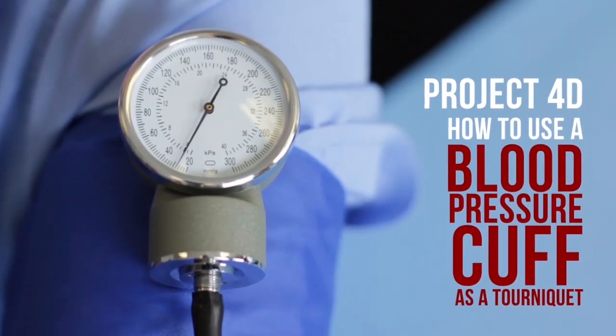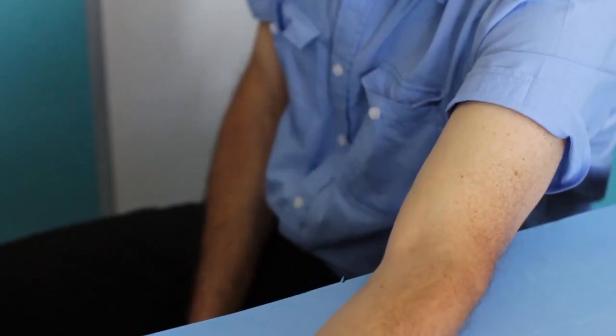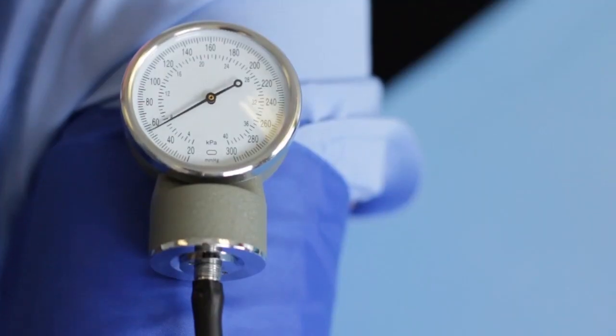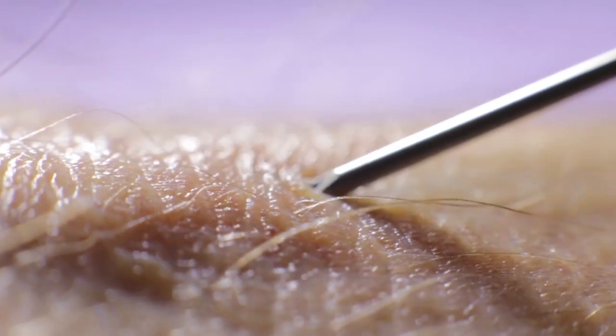Project 4D: How to Use a Blood Pressure Cuff as a Tourniquet. Apply a blood pressure cuff about four finger-widths above the intended venipuncture site. Inflate the cuff to about 60 mmHg. Proceed with the venipuncture procedure and deflate as soon as the task is completed.